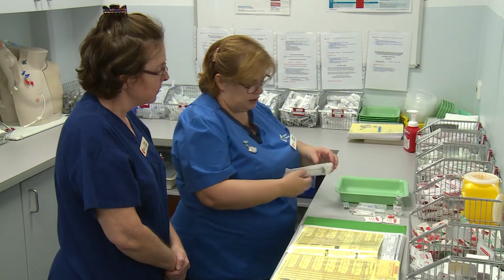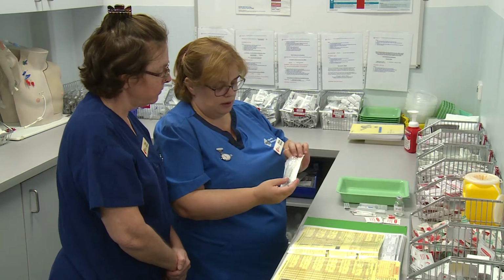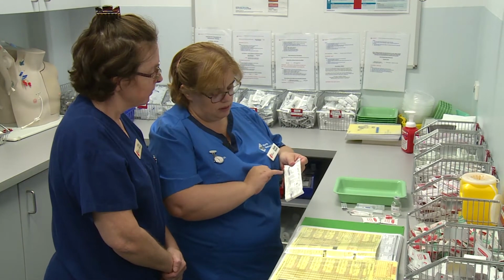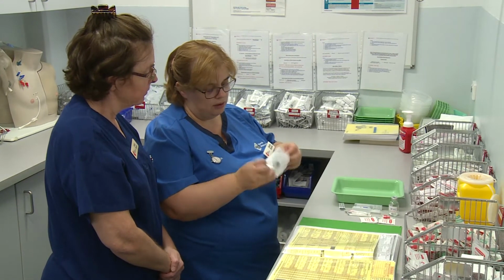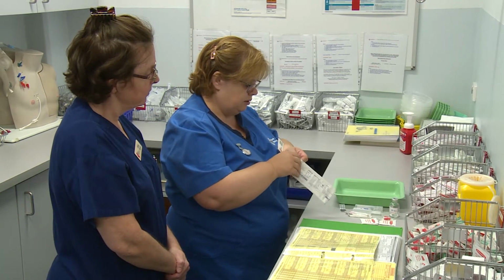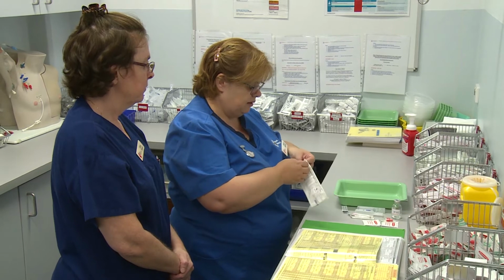Okay, I'm going to check the integrity of all my syringes. I'm using a Luer-lock syringe and it expires on 2024, and there's no holes or anything in that. So I'm just going to open that on the edge of my tray.